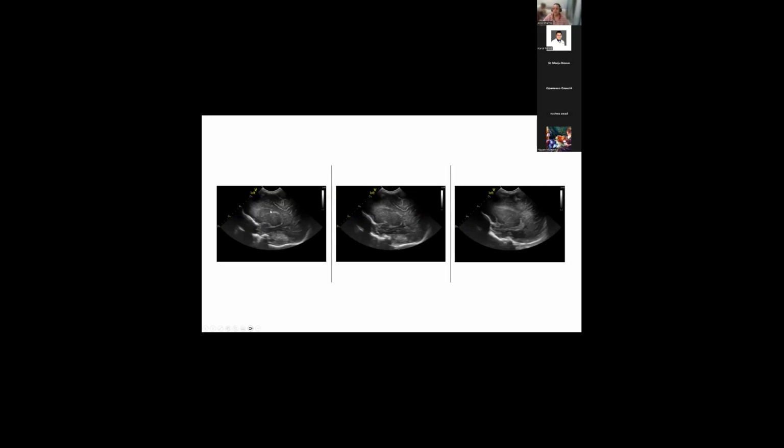Then when I move towards the left, the baby starts moving and I'm doing the scan on my own. So I really struggle to open the lateral ventricle up. I get a good image here. You remember, these are slit-like ventricles. It's never easy to see ventricles when they're really small, but I'm getting virtually the whole of the C here. Then I'm moving out towards the cortex and I'm getting bulky choroid over here.